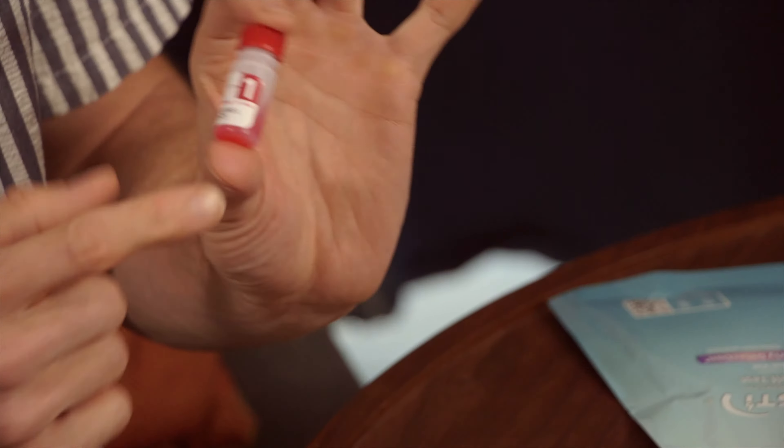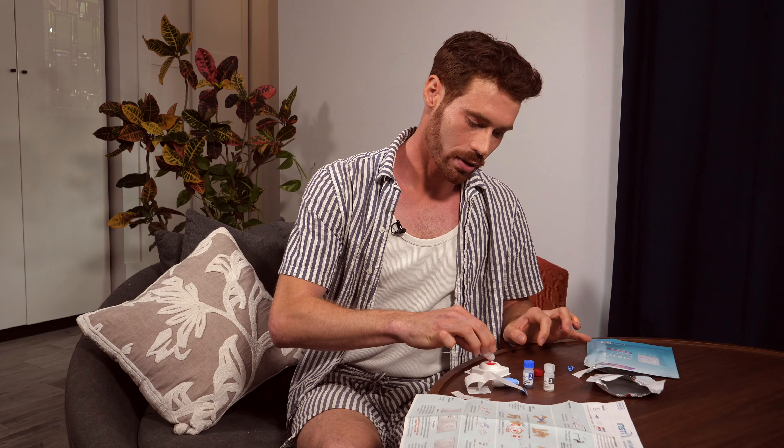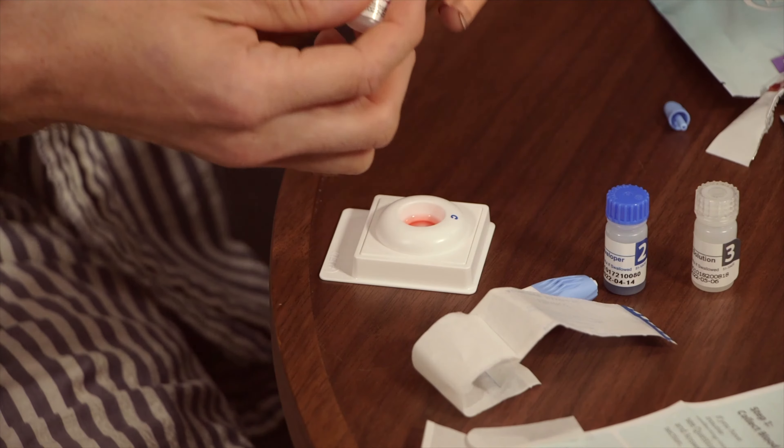Close the lid of step one firmly. Shake it four times. You really want to see this red color in the bottle before you pour it into the tray. Pour the liquid into the tray nice and slowly, and wait for it to absorb.